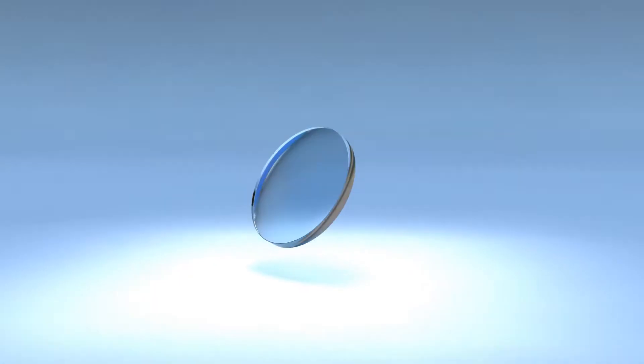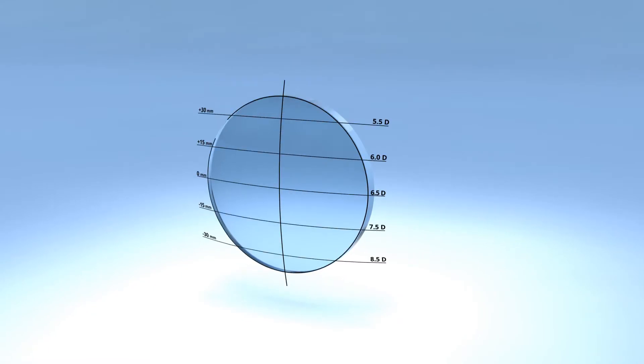The camber lens blank improves on the spherical lens blank by offering a continuously increasing base curve to better match the different powers in each zone of the finished progressive lens.